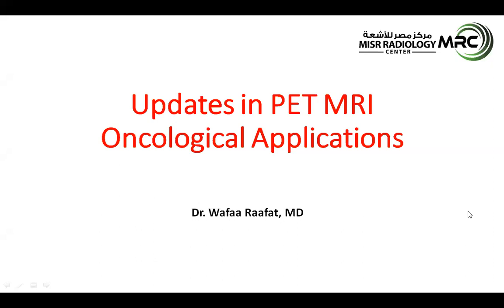I would like to share with you some highlights concerning the PET MRI oncological applications. We've been having the PET MRI for about a year and a half now. We've seen a lot of cases, so we have a really nice learning curve with a lot of experience with different oncological cases. So we would like to share this experience with you and to highlight the importance of MRI and when and in which cases to call for a PET MRI.